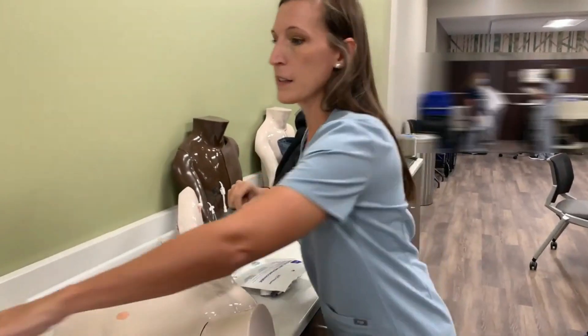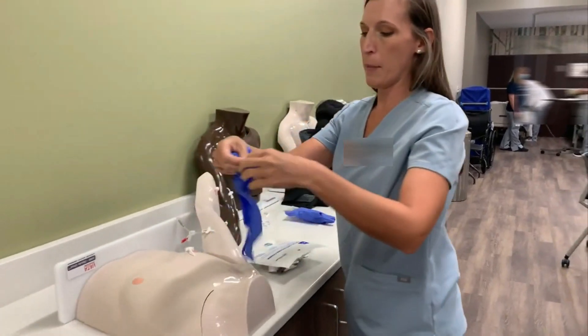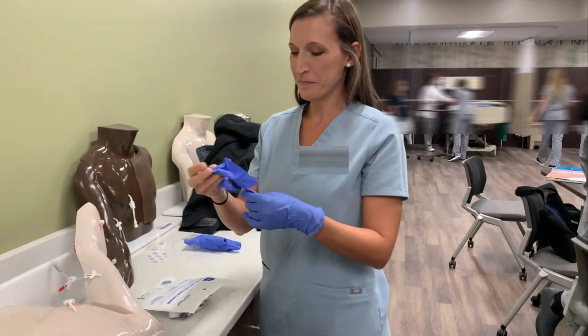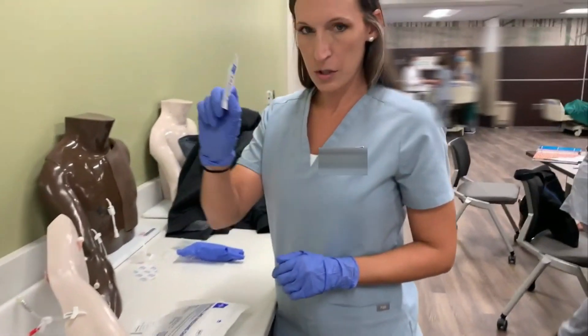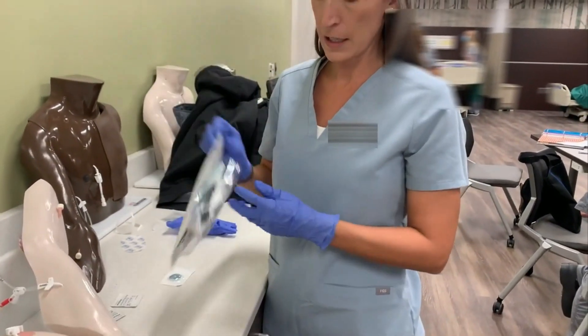Then get a new pair of gloves — you should have two pairs — to open your packages. I have a bio patch, which is usually used on central lines, and a central line dressing change kit.